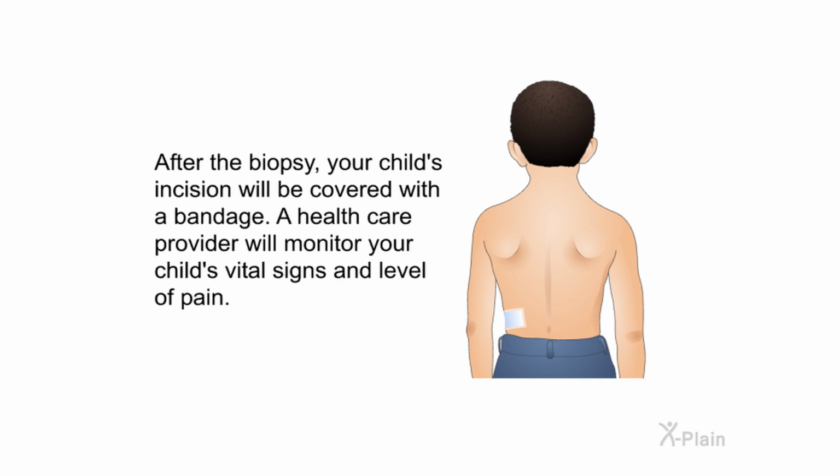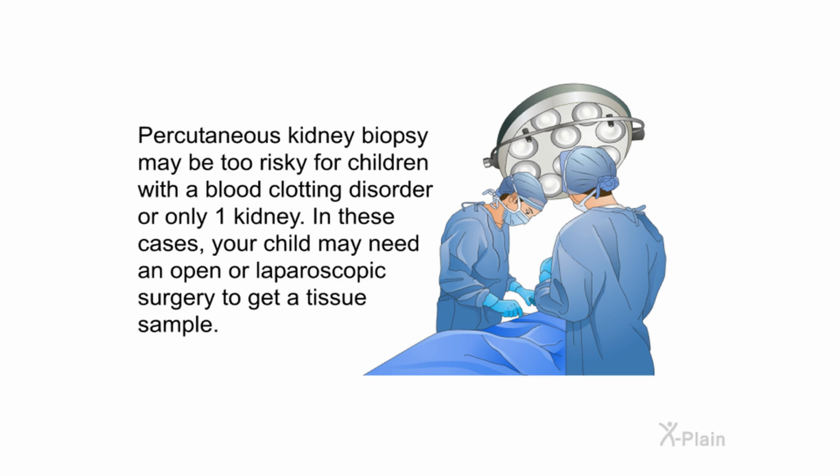After the biopsy, your child's incision will be covered with a bandage. A healthcare provider will monitor your child's vital signs and level of pain. Percutaneous kidney biopsy may be too risky for children with a blood clotting disorder or only one kidney. In these cases, your child may need an open or laparoscopic surgery to get a tissue sample.